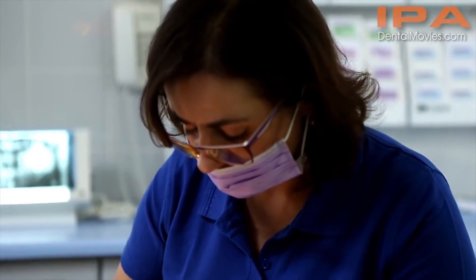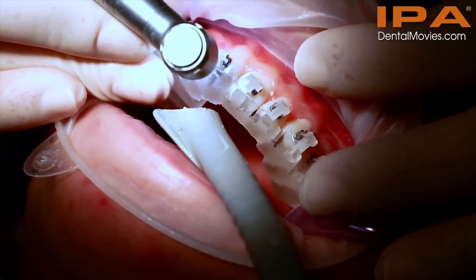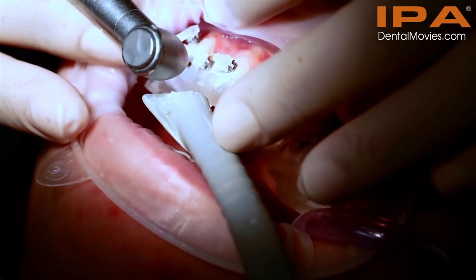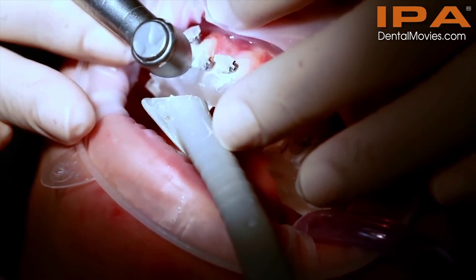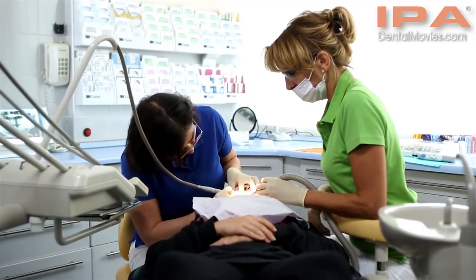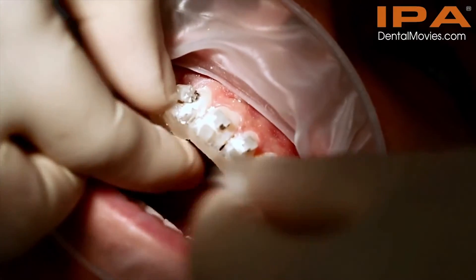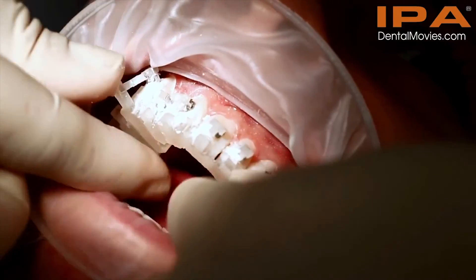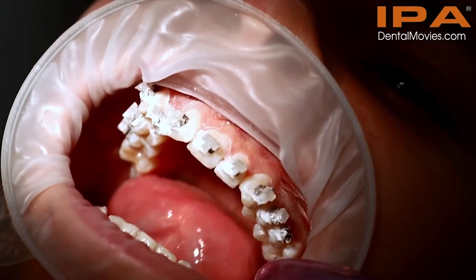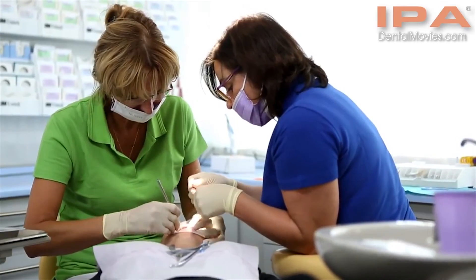The jig is then removed. To prevent the brackets from becoming detached from the teeth, it is recommended that the jig insets are cut off with a burr. After the removal of the jig, the insets are easily pulled out of the bracket slots. Alternatively, the insets can be broken out. You then follow your own standard clinical procedure.